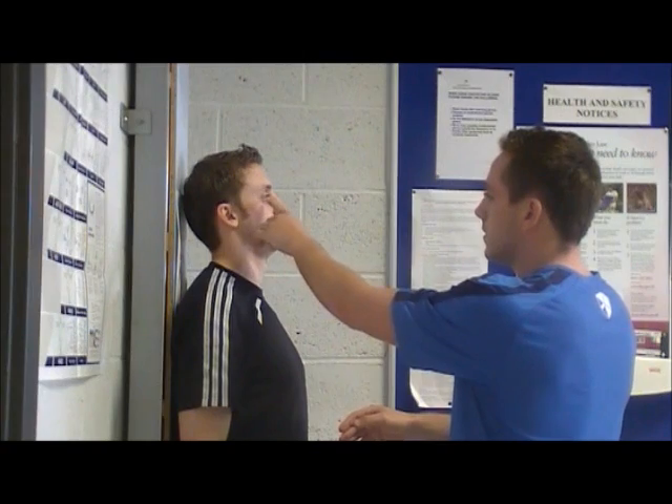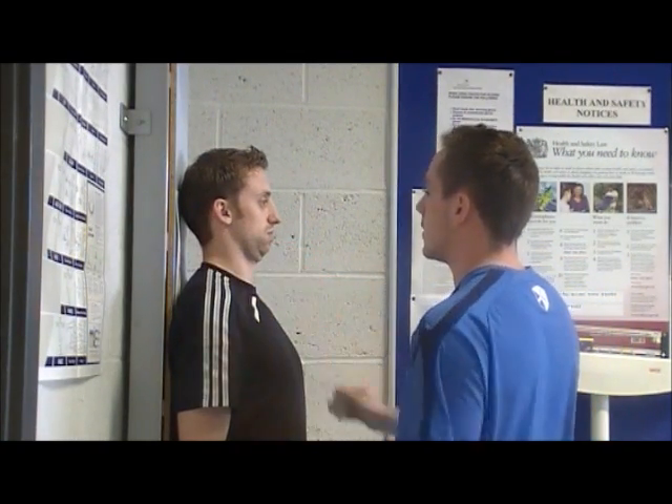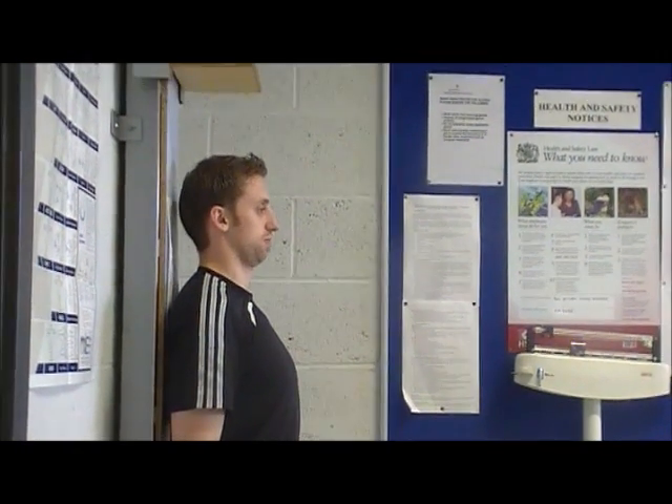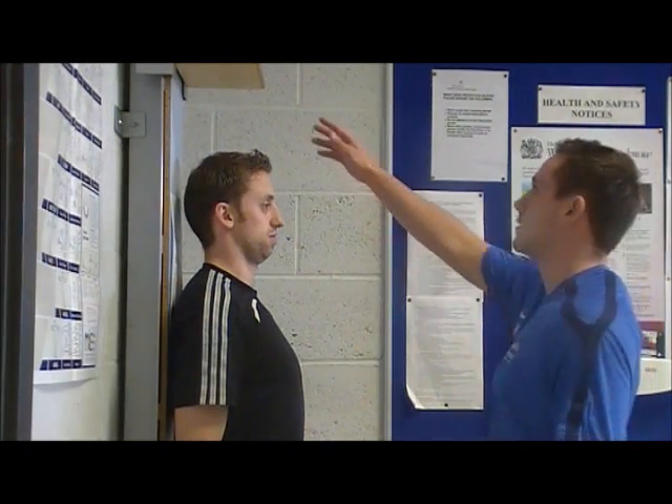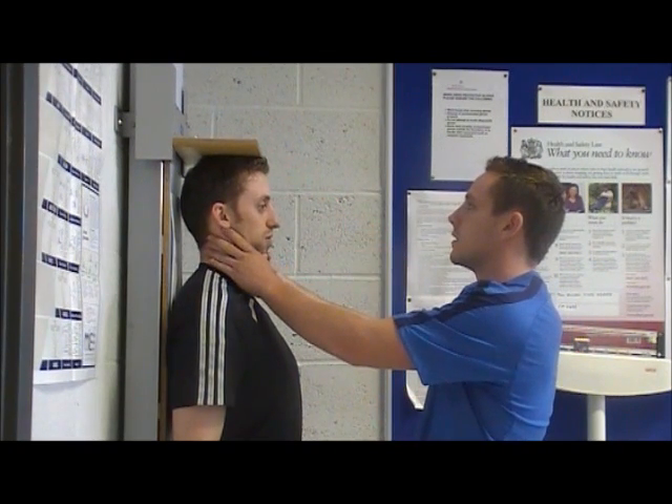Next, line up the middle of their ear with their eyes. Then gently place your hands around their chin and lower the boom onto their head. Be careful not to lower it too fast.